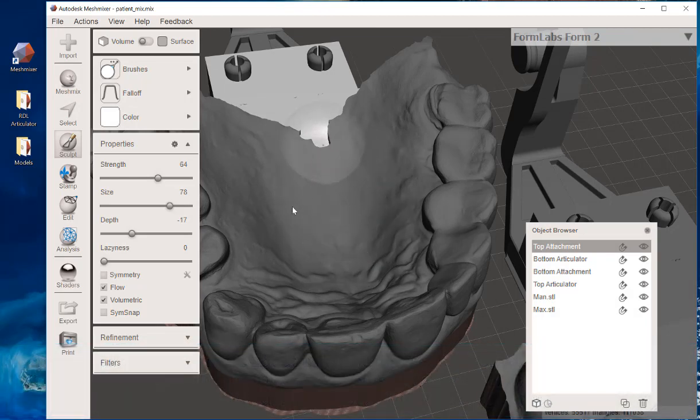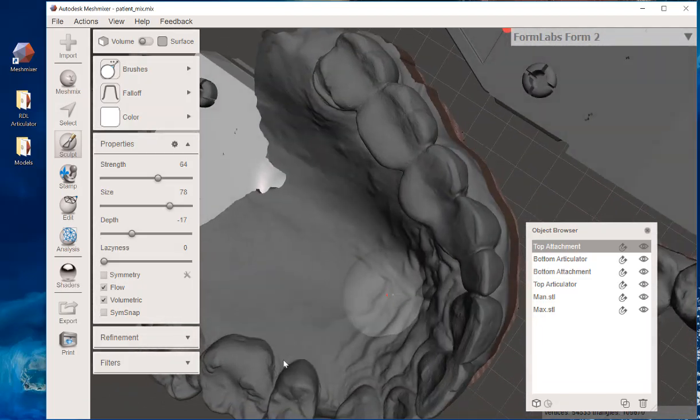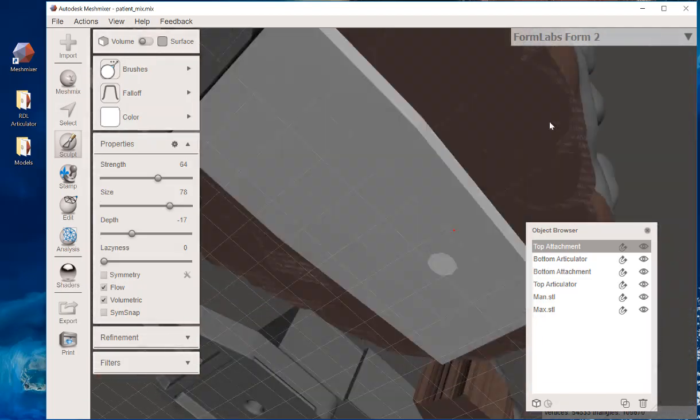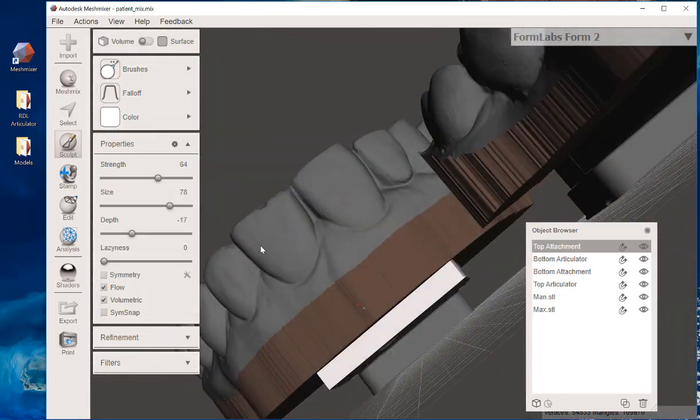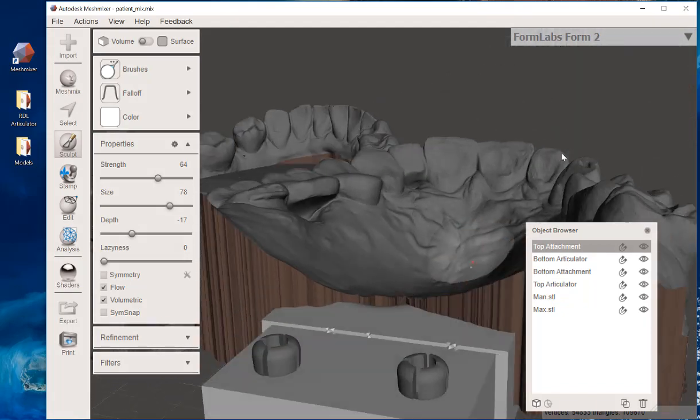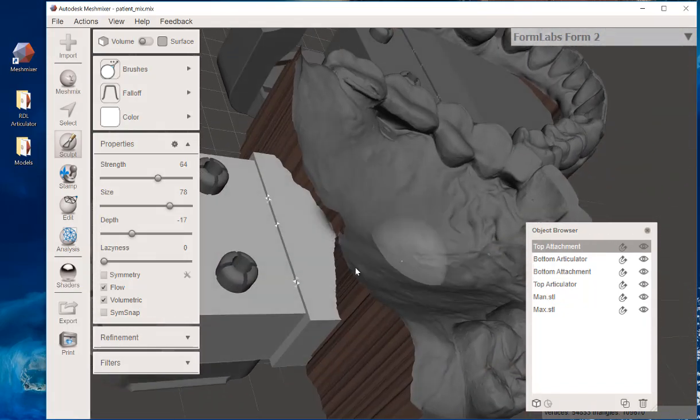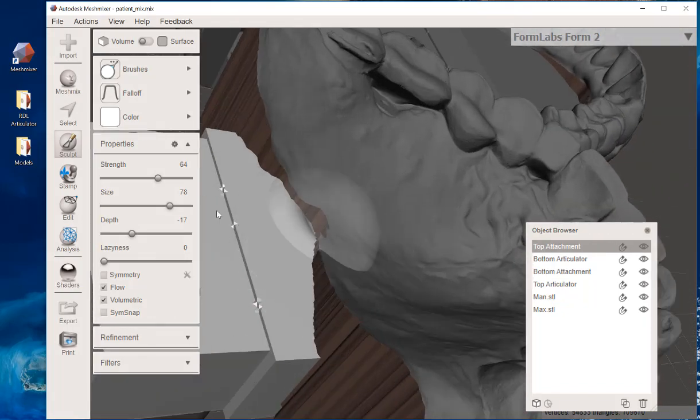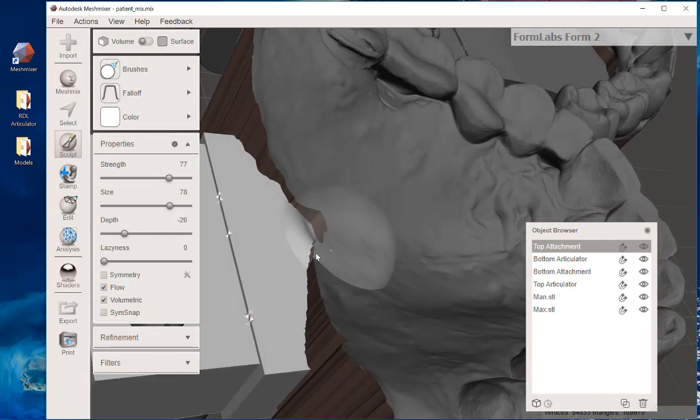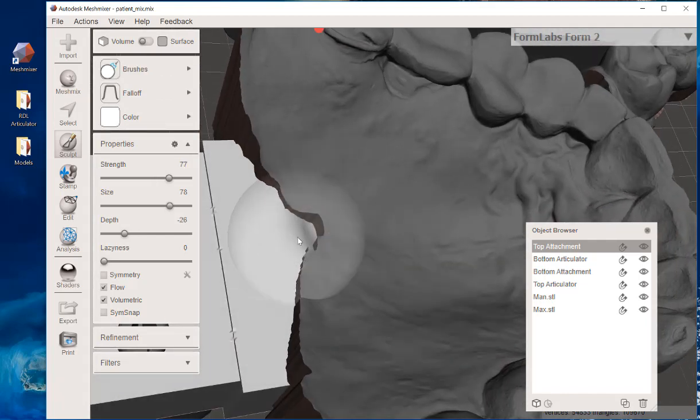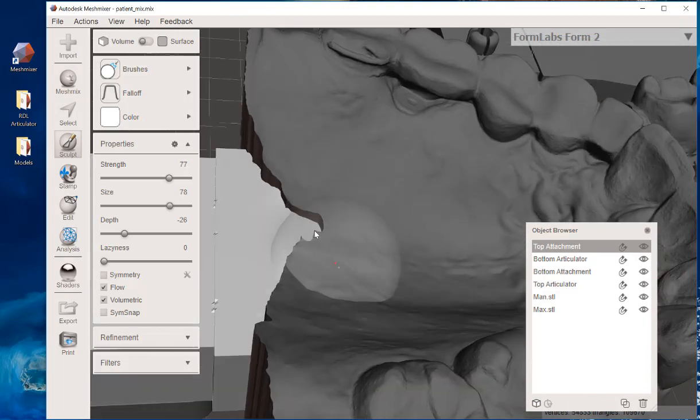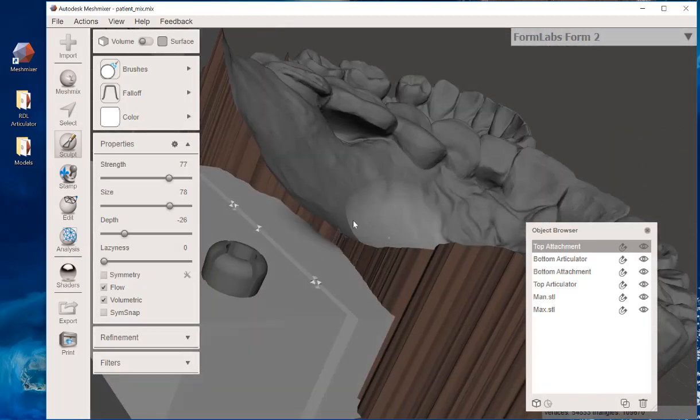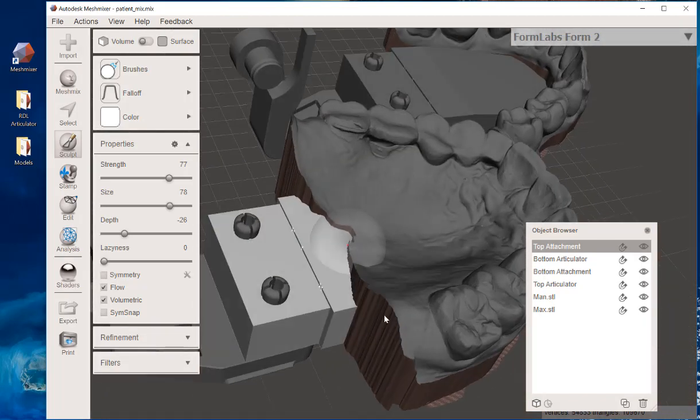And when you do that, it now has effectively blended those two files together. Just as a final touch-up, you don't have to do this, but I like to just to make it look good. Brushes, Shrink Smooth, no Control. Just hold down that left key and get that to blend in, and it's going to look gorgeous right there at that little junction.